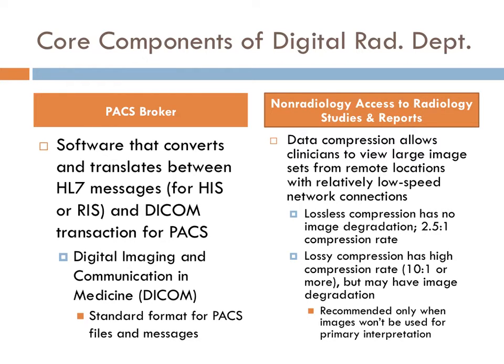So with the implementation of PACS, the clinicians or referring doctors who typically have access to view film-based images, they just come over to the department, or they request the images and the radiology department sends them over and they can view their images up on a light box. So when PACS is now implemented, they lose the function to do this. But that's not acceptable. So it is extremely important that these clinicians have access to the images and reports wherever they may be.